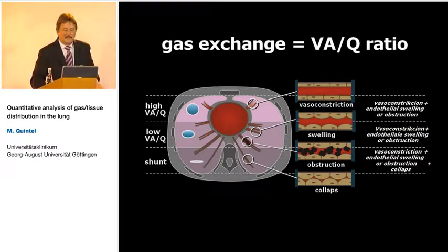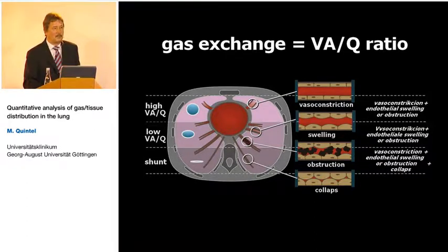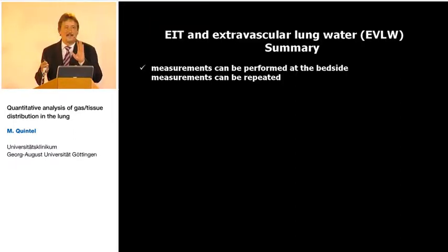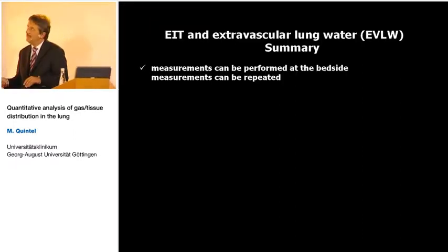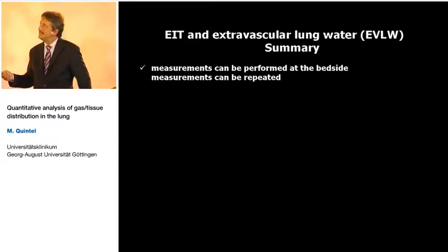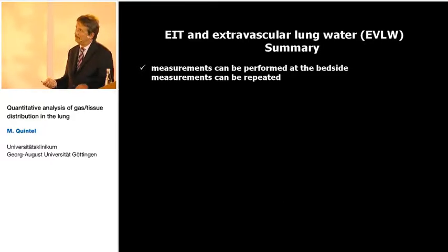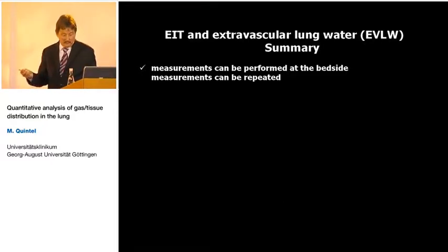Finally, I would like to close my talk by trying to summarize a little bit CT applications, and, though I know it's not complete, a little bit of EIT and extravascular lung water measurement. EIT measurements can be performed at the bedside and can be repeated in both directions.